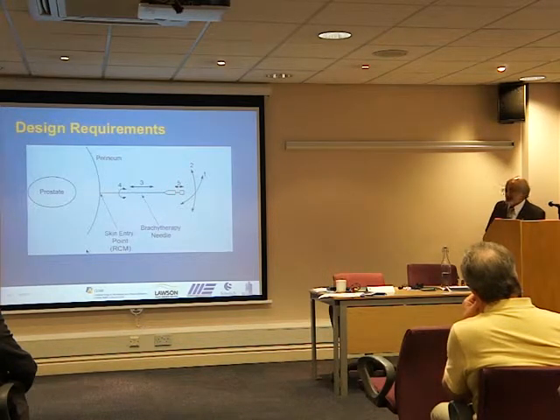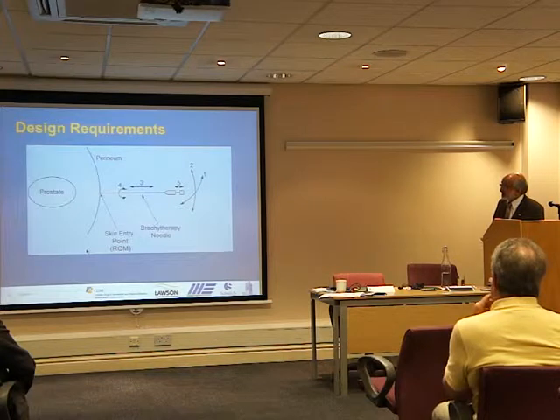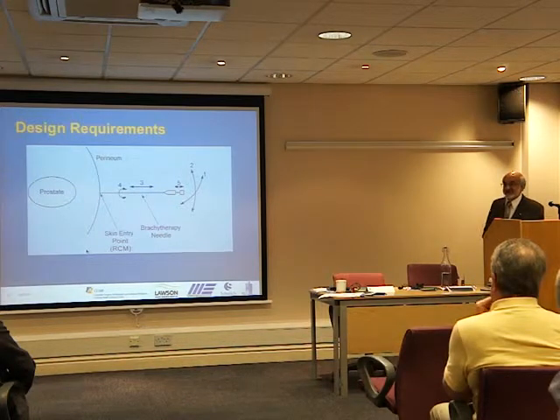So where the seed is dropped is that the end point of the needle is placed where the target is. The clinician then holds the stylet of the plunger and pulls the cannula back to drop the seed. So the seed will be dropped at the tip of the needle, rather than being pushed further in. Okay, so that's the standard process.